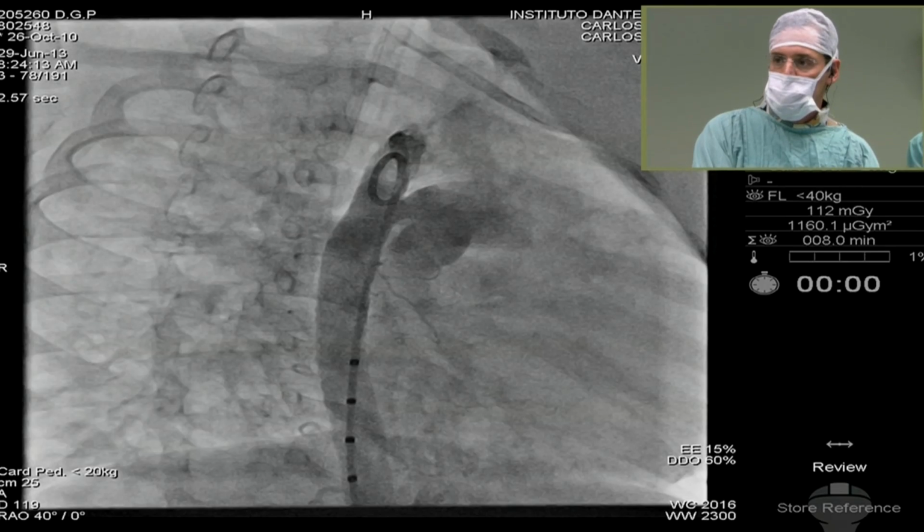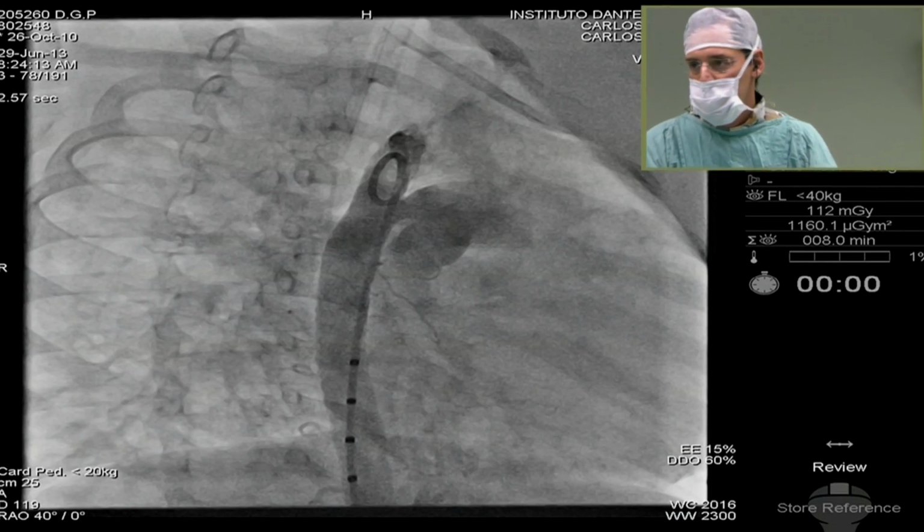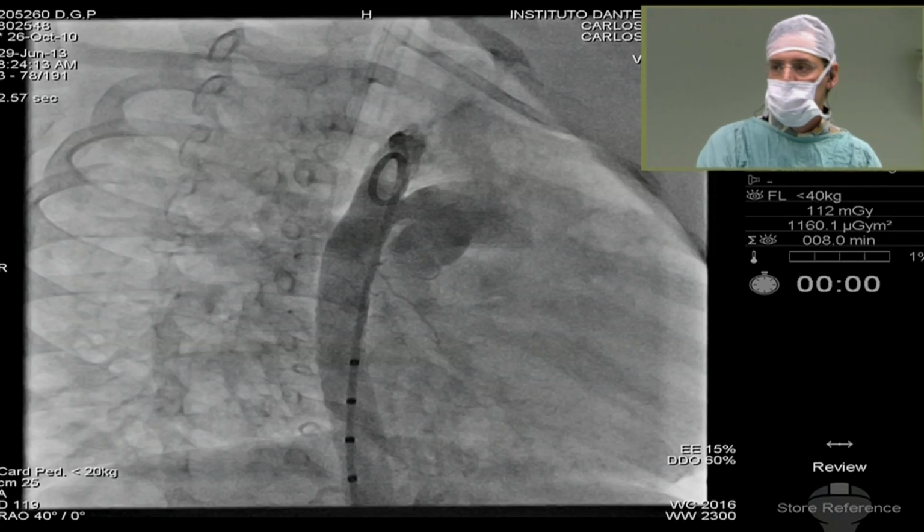It's not going to obstruct the aorta. Not much of an ampulla. However, the disc is flat, but the aorta is not flat. The aorta is a cylinder, isn't it? Yeah, the aorta. So you can achieve a compromise, but the two anatomies or two morphologies are not matching each other perfectly. In any case, yes.